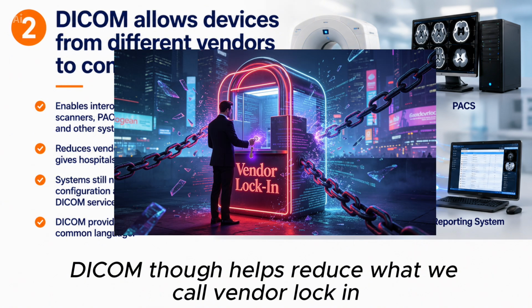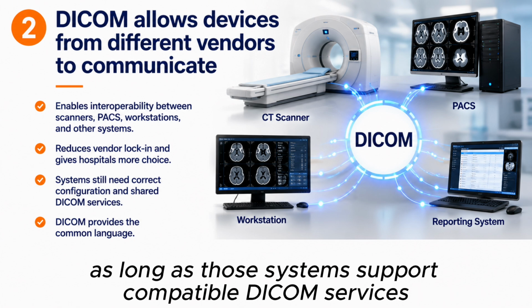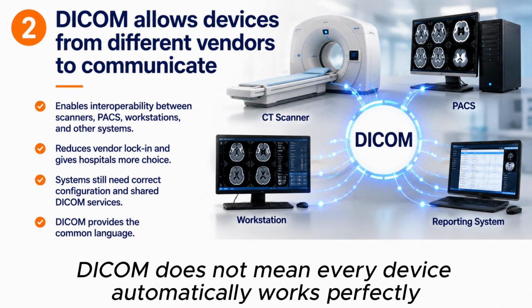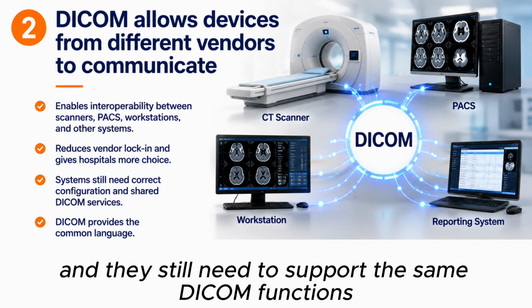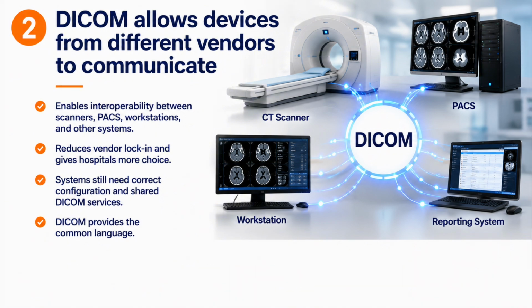DICOM, though, helps reduce what we call vendor lock-in, because hospitals can choose equipment from different manufacturers as long as those systems support compatible DICOM services and configuration. So, an important practical point: DICOM does not mean every device automatically works perfectly with every device. The systems still need to be configured correctly, and they still need to support the same DICOM functions. But DICOM gives everybody the shared language.